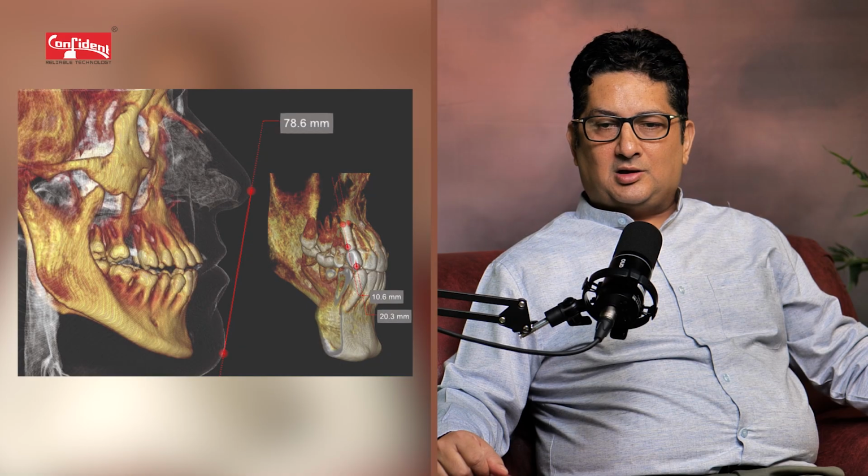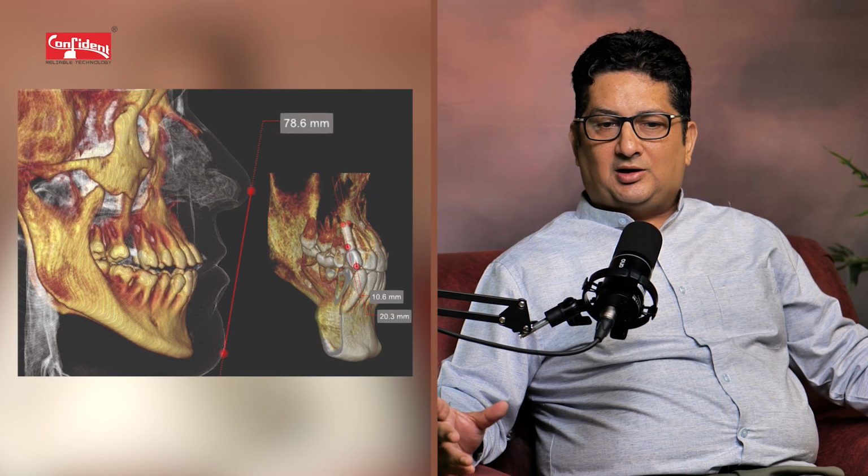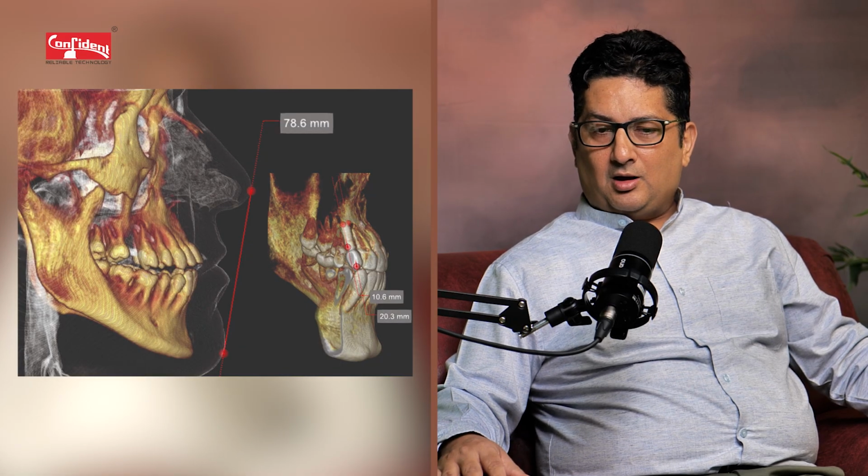Thank you, sir. So in a nutshell, AI models are becoming more predictable. They are improving over time; as the machine learns, the predictability increases. Right now we have CBCTs which can trace a nerve, which can tell the number of root canals, which can slice the images and give the pathologies and the bone density. However, a word of caution, a trained eye is necessary to operate this AI, and let the dentist be the master and not the other way around.